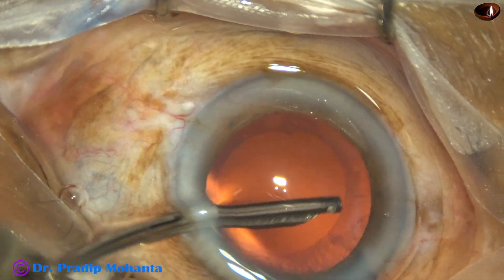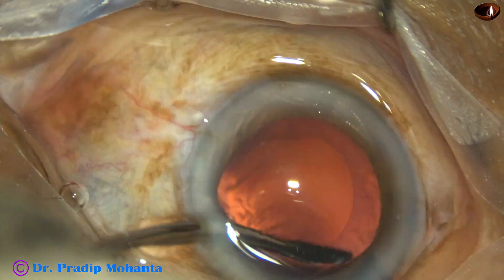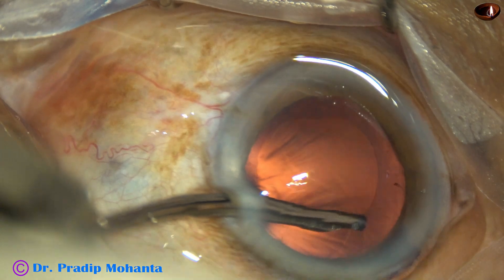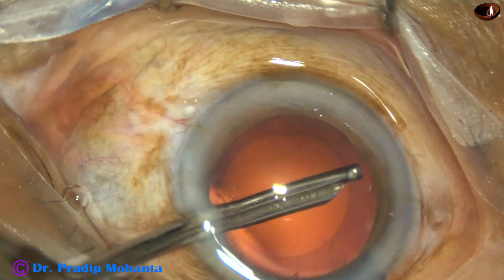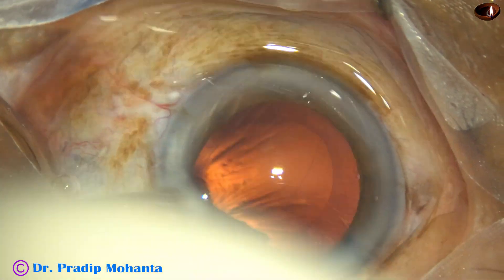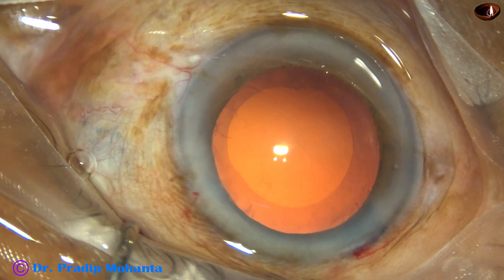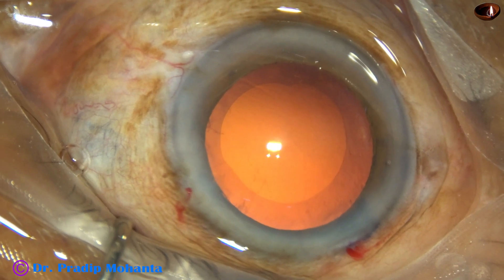So, the main step in intumescent cataracts is capsulorhexis. We must do a small rhexis first, aspirate cortex, make the intralenticular pressure low, fill up the anterior chamber again with viscoelastic, cut the margin of the mini-rhexis, enlarge it, and then do the nucleus management.